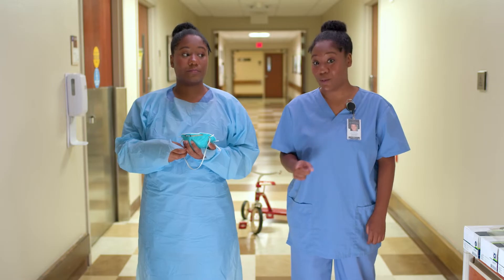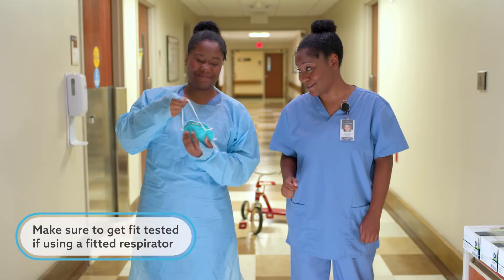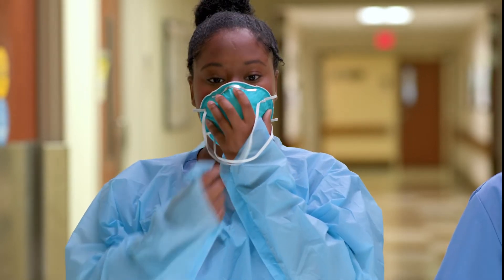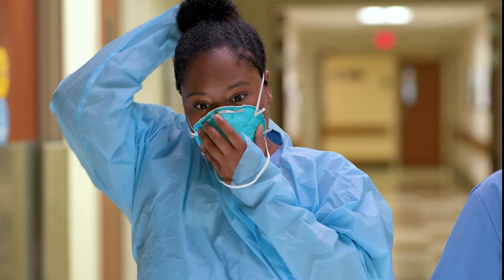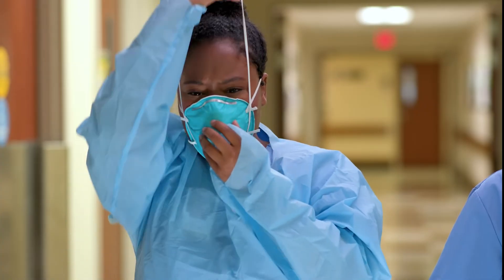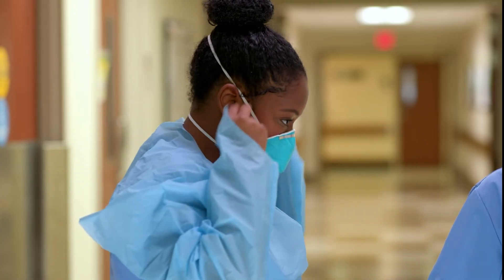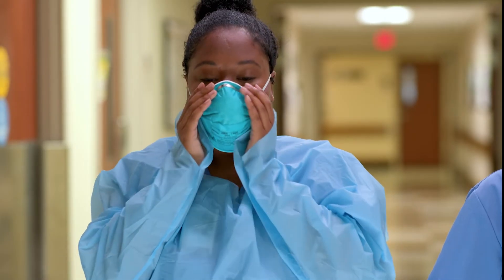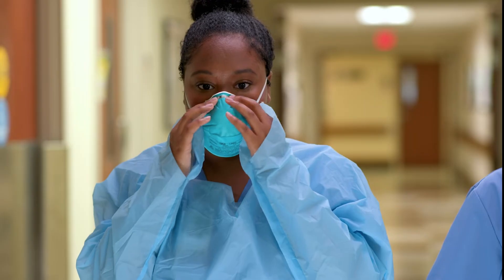If you have a patient on airborne precautions, you will need a respirator. Make sure to get a fit test for the respirator to ensure a correct seal. Make sure the straps are not tangled. Then place the respirator over your mouth and nose. Make sure the metal piece is on your nose. Take the top strap and place it just past the top of your head above the ears. Take the bottom strap and place it around the bottom of your head. Make sure the straps are not overlapping. Form the metal piece to your nose and perform the seal test. Blow the air out and feel with your hands if it's escaping. If it does, work the metal piece a little more or get refitted for a different respirator.